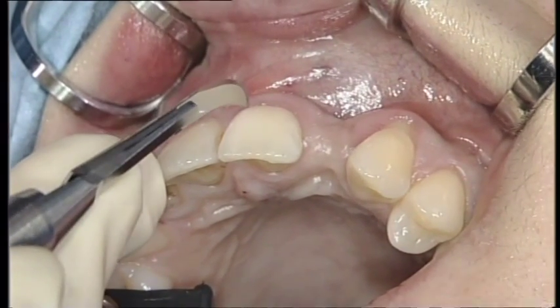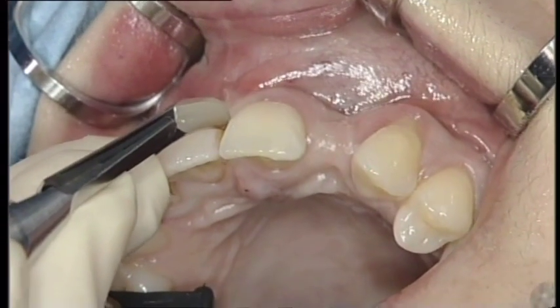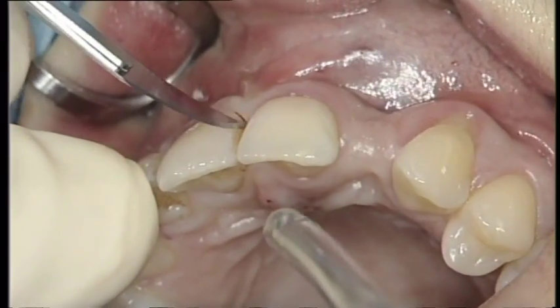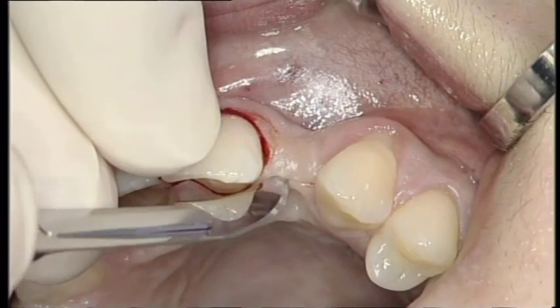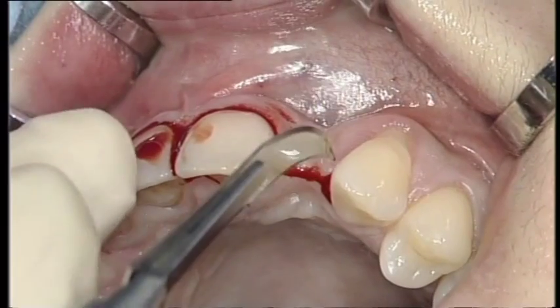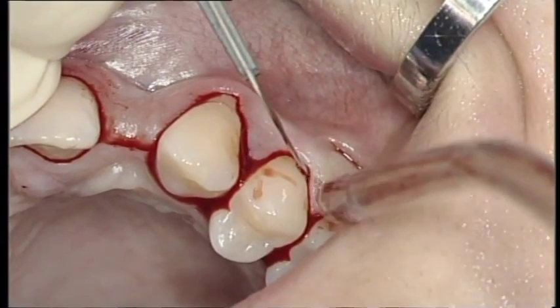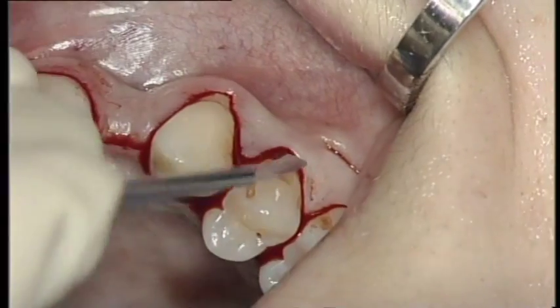The surgery begins with an intrasulcular incision from tooth 11, which is extended to the papillary area with a number 12 blade. In the edentulous area, a mid-crestal incision is made, followed by an intrasulcular extension to the first premolar. There, a vertical releasing incision at the distal line angle is cut.